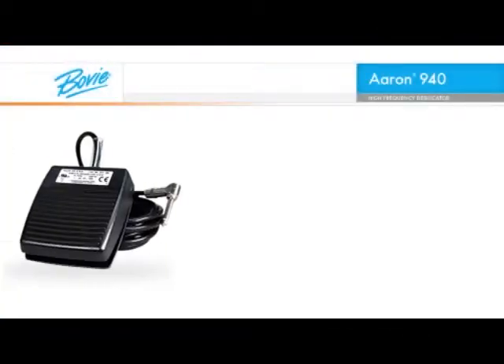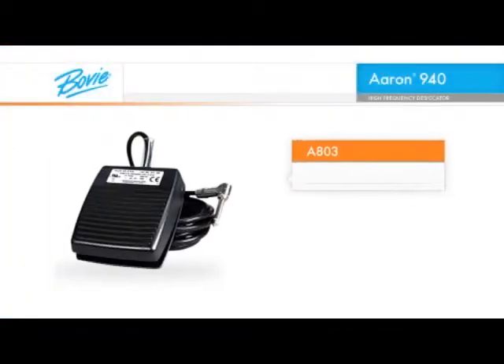If you need to use a foot control, just plug it in. There is no need for a separate handpiece, and you can still control the power setting from the handpiece while using the foot control.